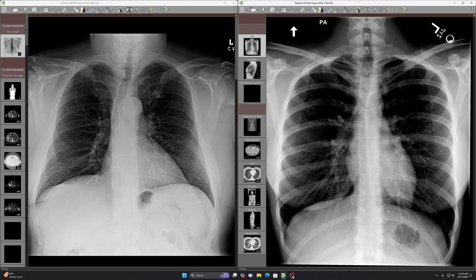Hi everyone, this is Rishi Agrawal. In this video I'm going to go over a chest x-ray with a very subtle finding. I posted the image last week, but here it is on the left. I'll give you a second to look at it and you could pause the video here if you want.